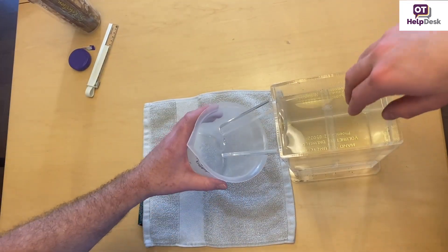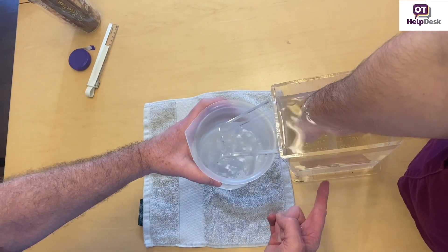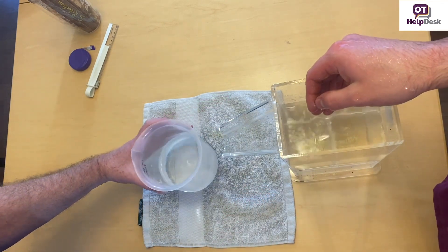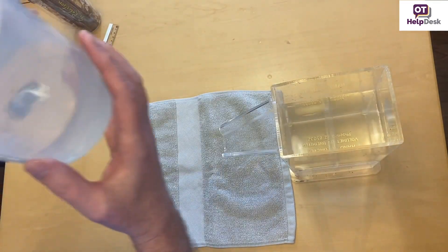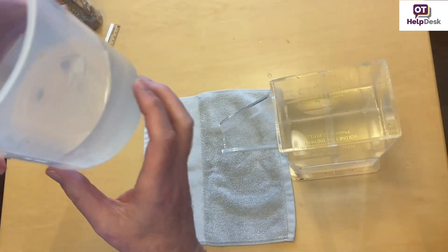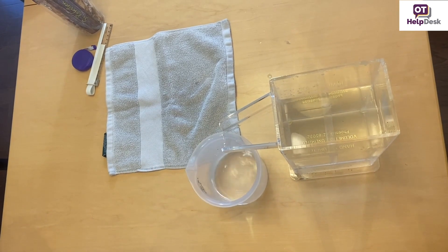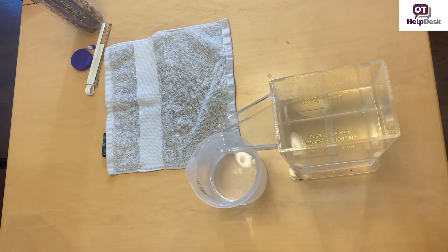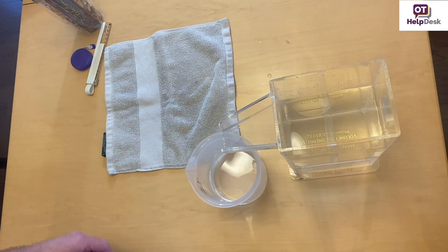Go ahead and stick your hand in there, Joseph — all the way down in, all the way until it's done. Now we have our readings. Here's a towel, Joseph, you can dry your hand off. I'm going to turn this and put it down on a flat surface and read it. Joseph for the right hand is 475 milliliters. I always tell the patient to remember that, or I write it down.